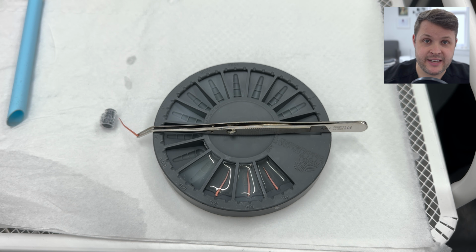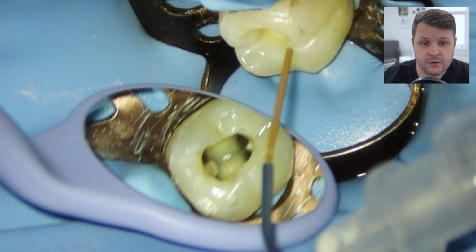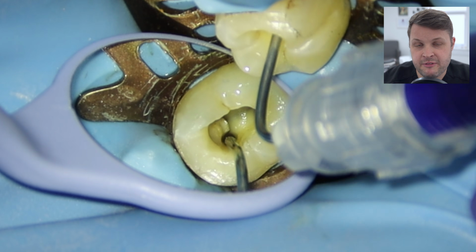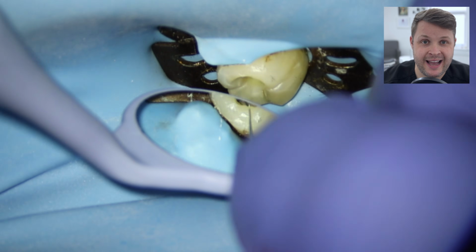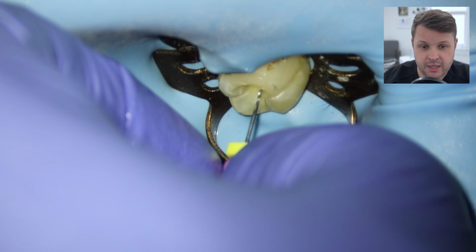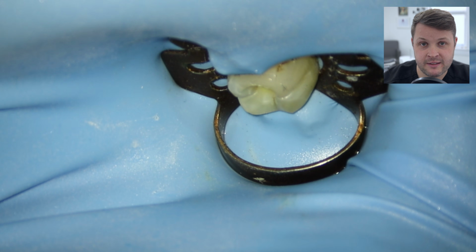Then I move over to the canal, and I'm going to load the canal with my bioceramic sealer, maybe a third of the way in the coronal third. And now what I like to do is introduce a hand file into the canal. I never used to do this, but I feel like this gets rid of any vapor lock, and it also introduces the sealer into the full length of the canal space.